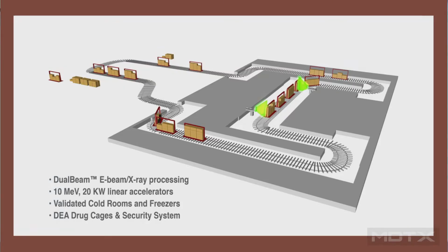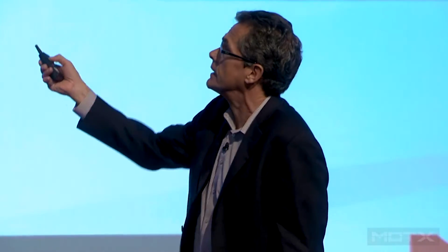So there's less time for oxidation to occur. That's why the post-sterilization functionality or performance of products sterilized by E-beam is superior to gamma. So with our dual beam system, the totes will travel in front of one E-beam accelerator and get dosed on one side, and then travel about 10 feet further and get dosed on the other side. And basically, once it comes out, it's a parametric release or dosimetric release. Hypothetically, the product that is processed there could go directly into a surgical suite and be implanted into a patient.